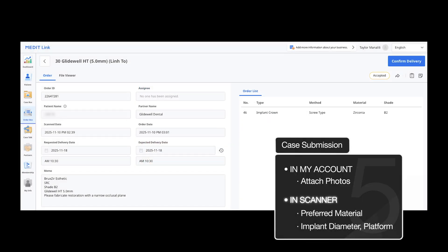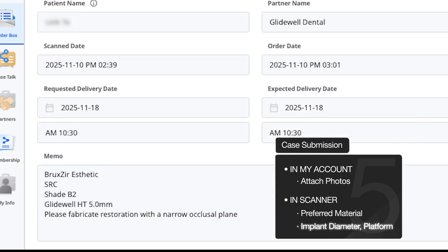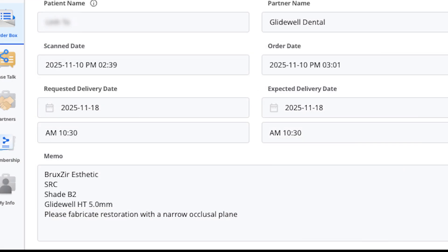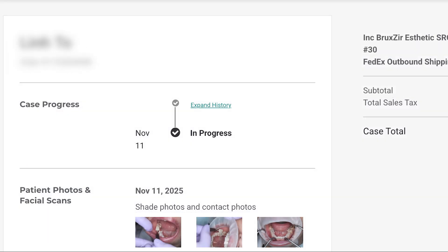Provide clear notes for your technician such as preferred material, implant manufacturer, diameter, and/or platform. When everything is reviewed, proceed to submit the case. Once submitted, Glidewell will confirm receipt on your My Account portal and begin case design shortly thereafter.